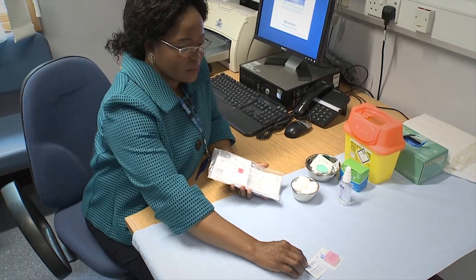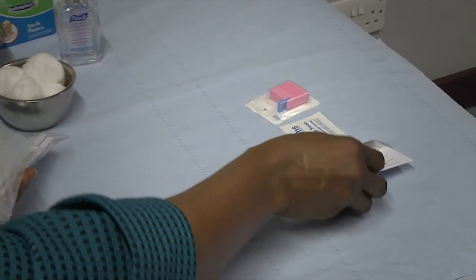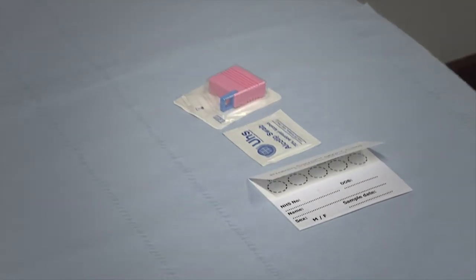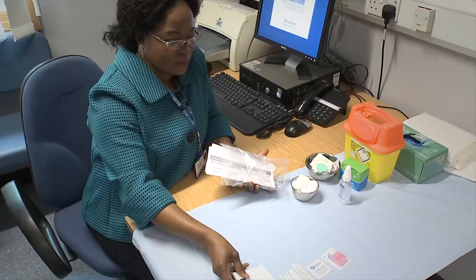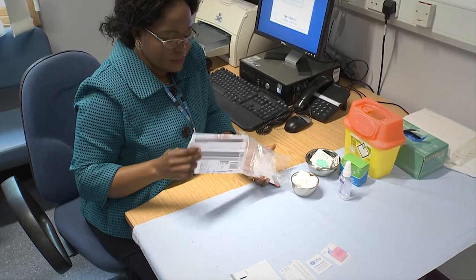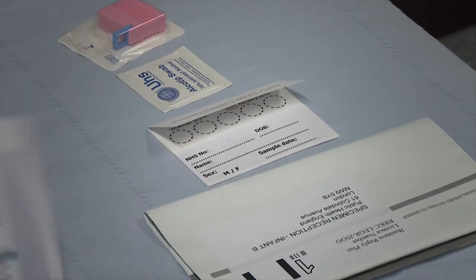Before undertaking the blood spot test, check that you have all the necessary equipment. The dry blood spot kit should include a lancet, an alcohol wipe, a dry blood spot card with filter paper, a prepaid specimen bag, an infant hepatitis B virus request form, and a pictogram outlining the procedure.